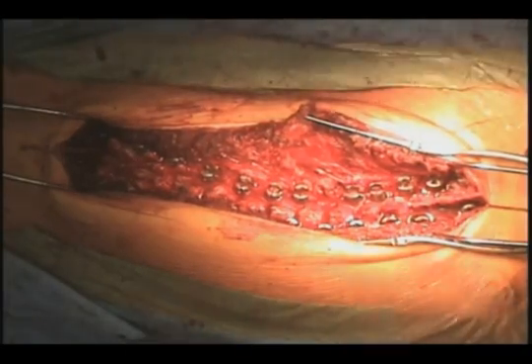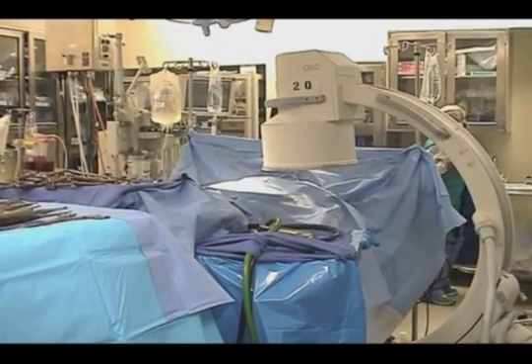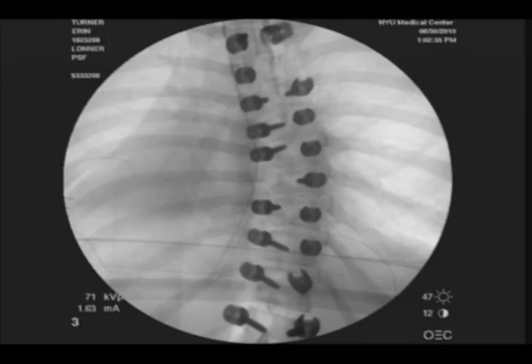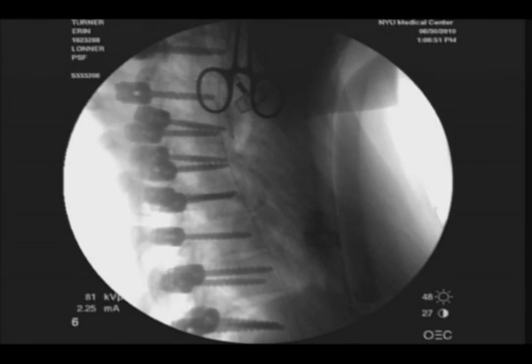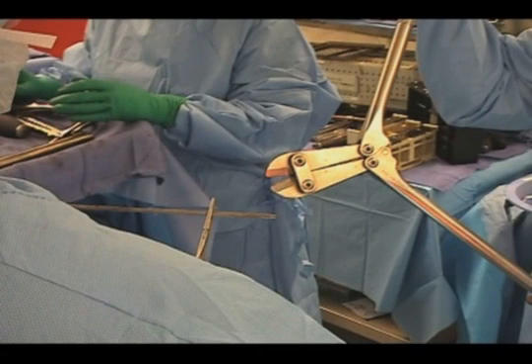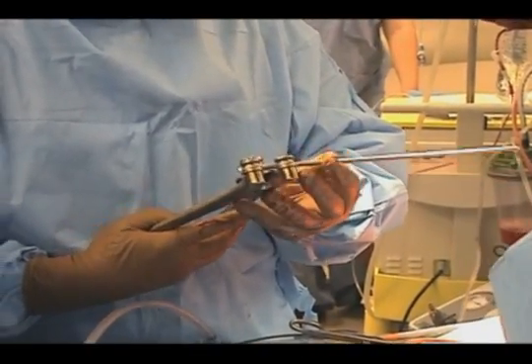So we take as a baseline 7 milliamps as indicating that there's an intact cortical bony margin around the screw. Here we check with fluoroscopy. So after I've placed the screws in a freehand technique, we check both on a PA and a lateral fluoro to ensure that the screws are in good position, and we can arc the fluoroscopic machine to assess the trajectory of the screw.